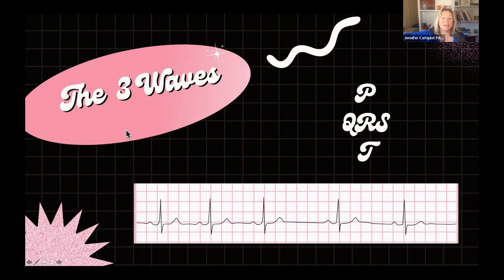P waves are present. I like that. That's a good answer. Okay, we have lots of P's in the chat. I like where you guys are heading with that. Tell me about the width of the QRS. Yeah, okay, good. So a rate around 60, that's usually helpful. But tell me about the width of the QRS if it's coming from the atrium. Okay, good. It's a narrow QRS.